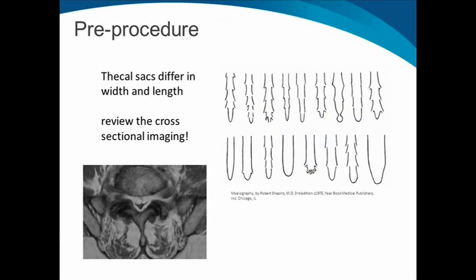How we perform the myelogram also differs slightly from what is typically published in the literature and what is done at outside hospitals. Typically, the subarachnoid space is classically accessed at the L3-4 level or perhaps the L4-5 level. At this institution, we have vast experience with puncturing at the L5-S1 level if the thecal sac extends down to that level.